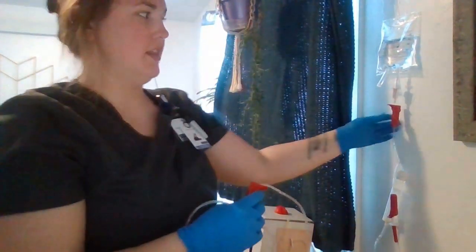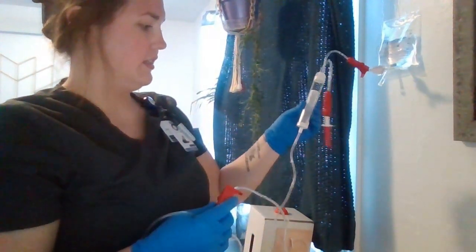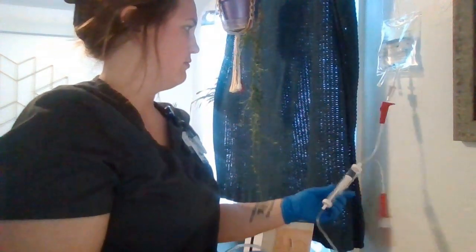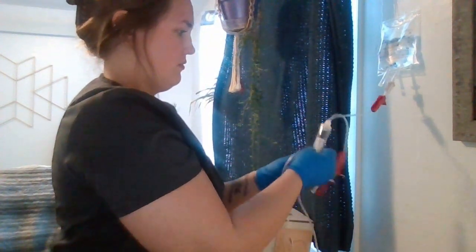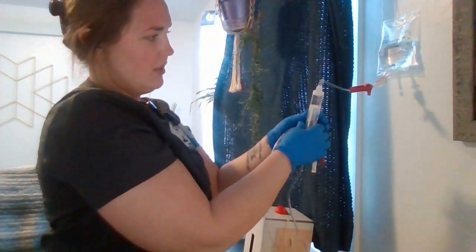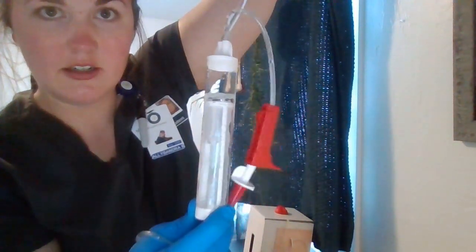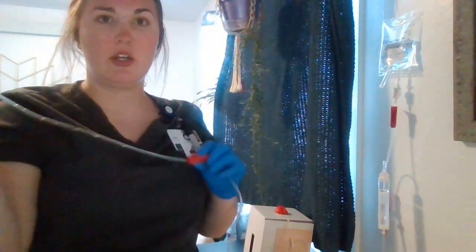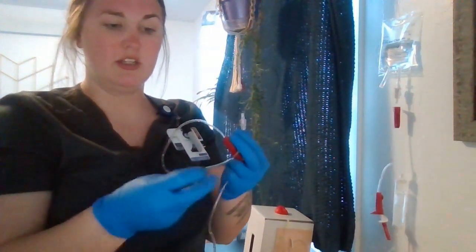Once I've done that, I can open the top clamp and I'm going to make sure it flows into this chamber. I'm going to squeeze it until the chamber is full, so it's slowly filling the chamber. I want to make sure that the saline is covering the filter. Now that it's covering the filter, we can prime our tubing. I'm going to start by putting this over a trash can, taking the lid off and making sure that I don't touch the end of this or the inside of the lid.